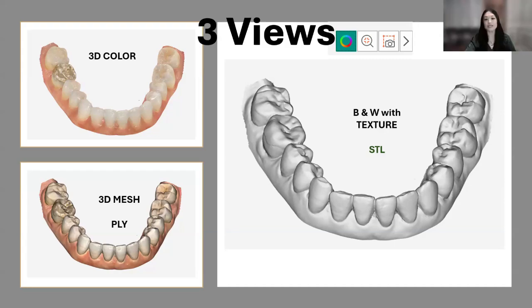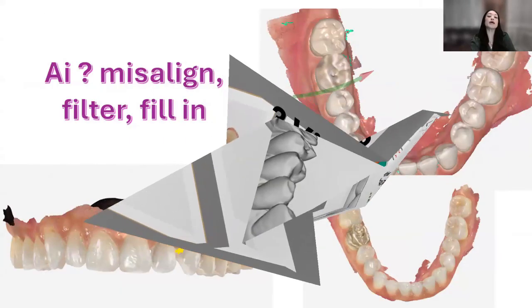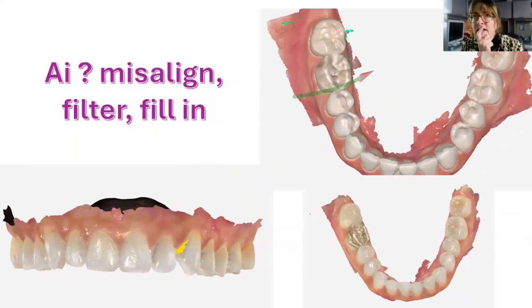Yep, yep, that is STL. All right, so let's talk about what else we have in the software. As a matter of fact, Jen, most laboratories are using the monochrome or stone model mode for their design work, right? So yeah, they have the view of the color, but when they're actually designing it, specifically in 3Shape, they are using the monochrome. With exocad, we're also using color, but the technicians and the way the design software is set up, it's easier to view for them in the stone model mode. I agree. Yeah.